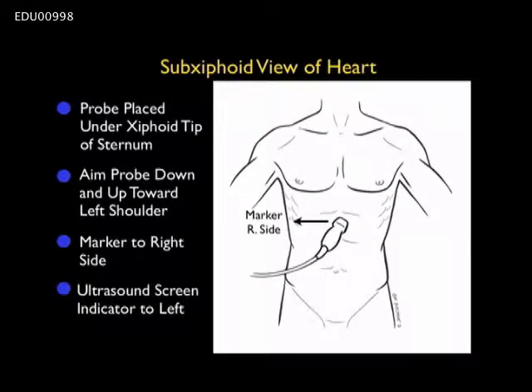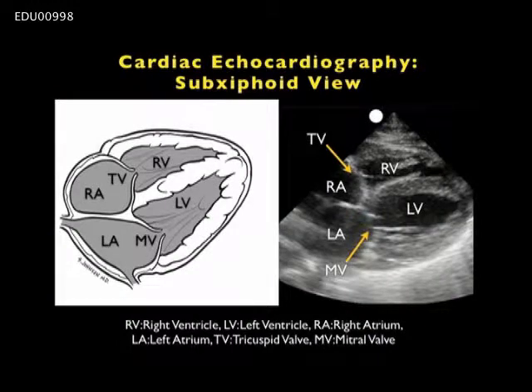The next cardiac imaging window is the subxiphoid. The probe is placed under the xiphoid tip of the sternum, aiming down and up towards the left shoulder. We keep the marker dot on the probe towards the right side of the patient, with the caveat that the ultrasound screen indicator is positioned to the left of the screen. From this view we're looking from an inferior position up towards the heart, using the liver as our acoustic window. The right ventricle and right atrium are close to the probe, and further away are the left ventricle and left atrium. The tricuspid and mitral valves can also be seen from this view.